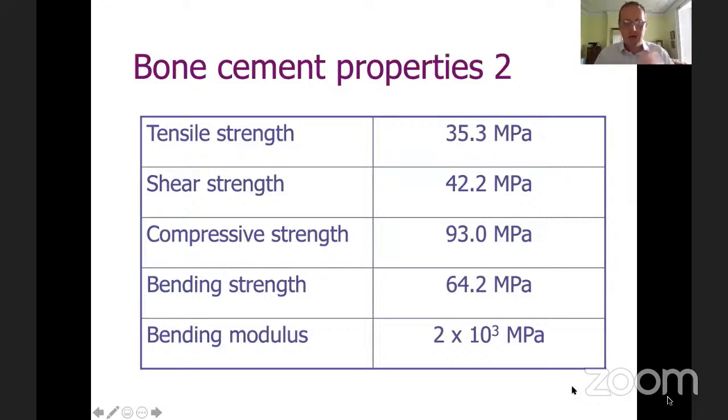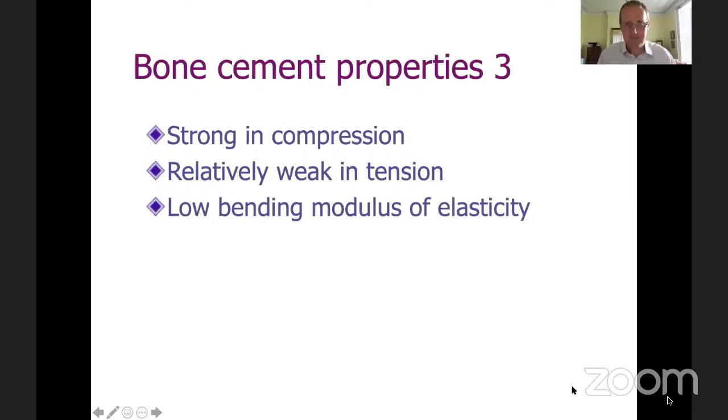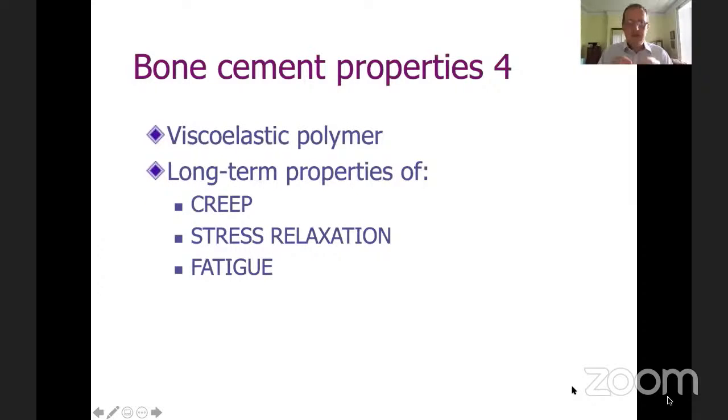And so obviously any that you use are stronger than these and flexible, such as these. And as with everything on this planet, most things are stronger in compression than they are in tension or in shear. And that's just the same for bone cement itself. But it's a fascinating material because it's a viscoelastic polymer. So although a solid, it demonstrates some more liquid type behavior at various temperatures. And once it gets those changes in its behavior and demonstrates their viscoelastic properties, then we can understand and utilize those because they are creep and stress relaxation, which are helpful.